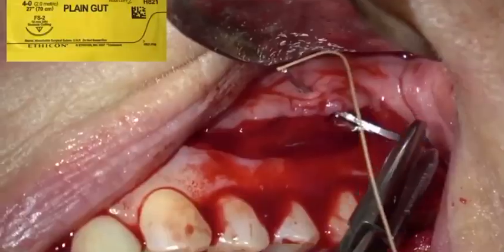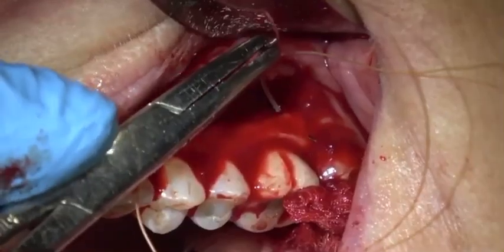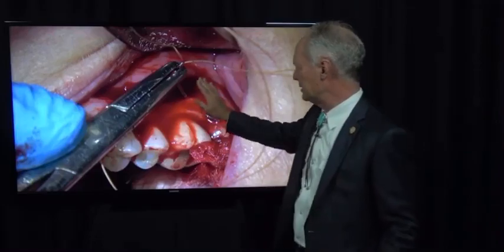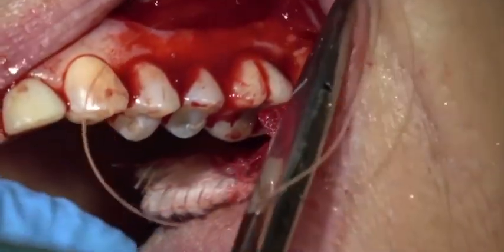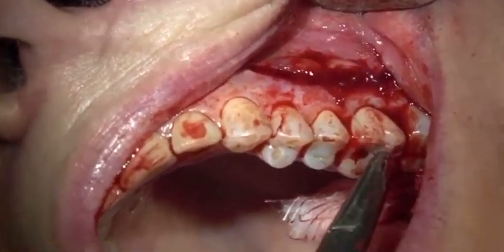This is 4-0 gut suture. Because I've undermined the coronal part of the flap, it's easy to suture underneath there. If the tissue is attached to the gingiva, it's very difficult to place the suture under the flap or under the gingival tissue.